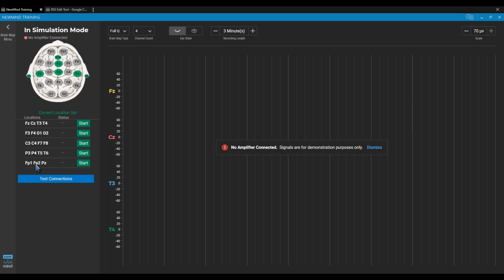I already know the database is going to recommend that I train in those locations because the artifact just makes them end up being the worst areas in the brain. So I just ignore the protocol recommendation. I ignore the locations, and I look at everything else. And generally I'm working most of the time more in the dorsal stream anyways, unless I'm working T3, T4. So if it is F7 and F8, I'm generally not going to be as concerned.